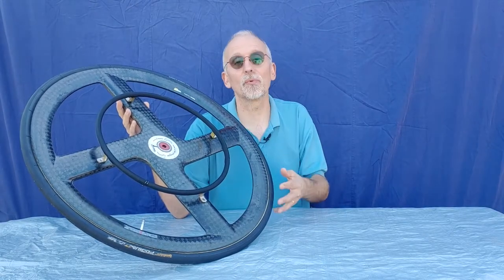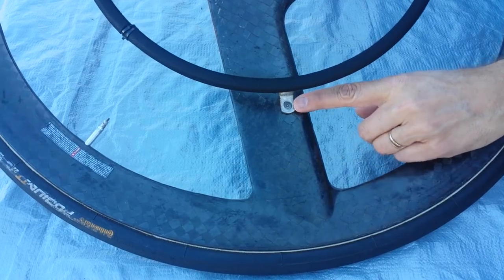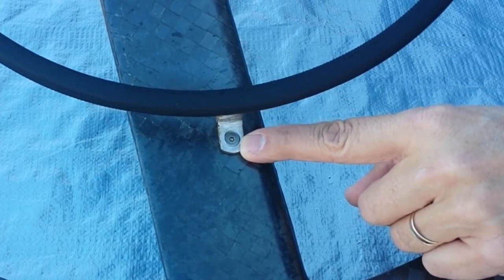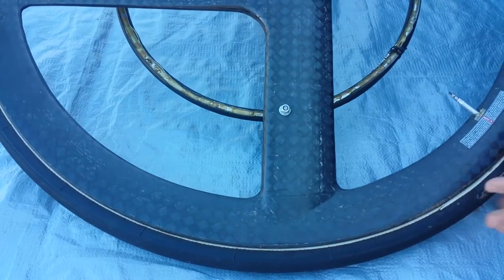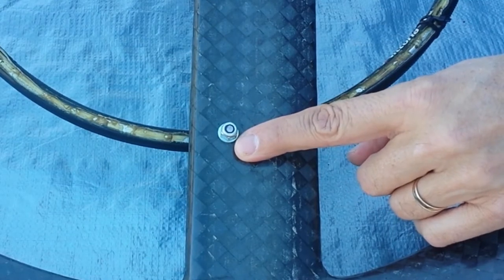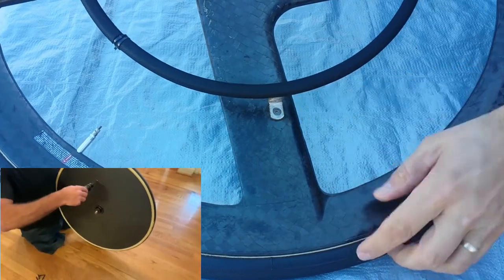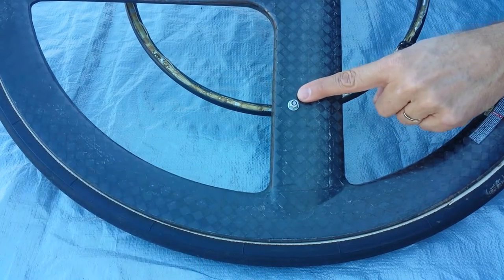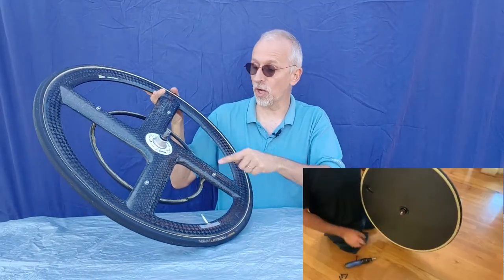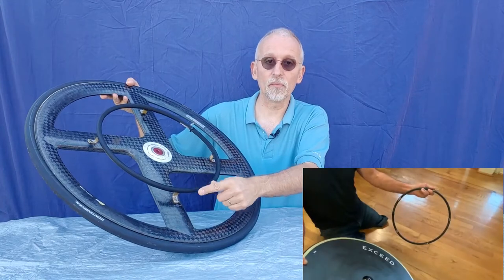The first wheel and hand rim type we are going to look at is a carbon fiber wheel. It is probably the easiest to work with. All it has is a bolt — it may have a hex head or allen key head, or another type — and on the back side there is just a nut and a washer to hold it on. You need whatever appropriate size tool fits the bolt head, then use either a wrench or a socket on the nut. Loosen the nut and washer, then remove the bolts and separate the hand rim from the wheel.